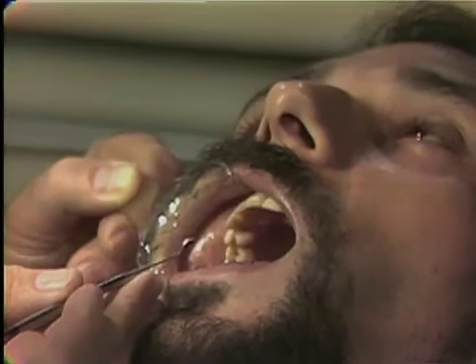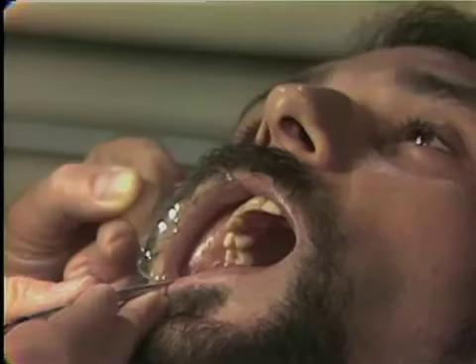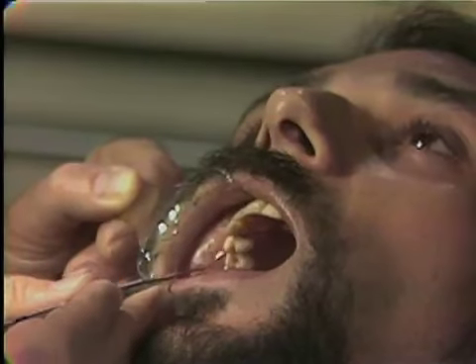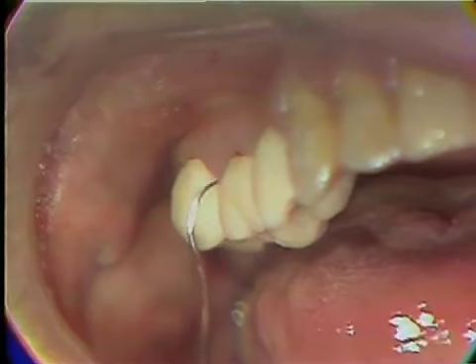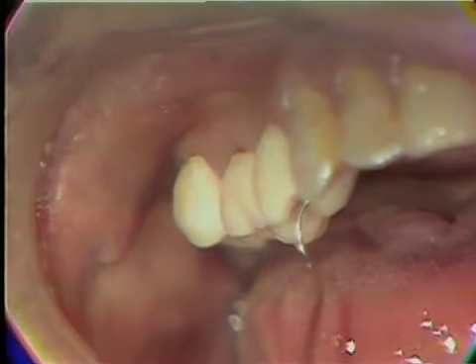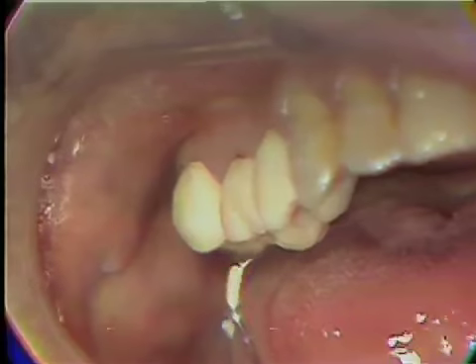The purpose of the temporary is to keep the teeth in the exact same position as you recorded in your working cast. So you need temporaries that will keep the teeth together. If you've got periodontal inflammation around the teeth, they could be elevated out of the sockets a little bit, and you would have a discrepancy when you went to try the crowns in.